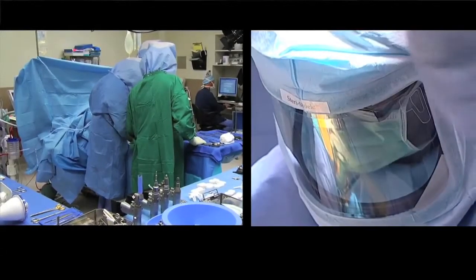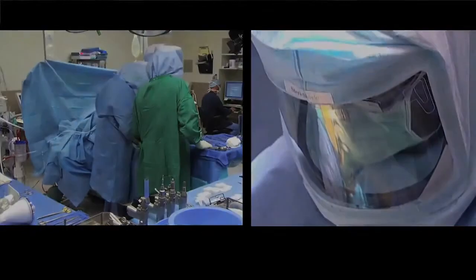So what it means for the surgeon is that in every single surgery he is confronted with having to find compromises, having to oversize one condyle, the inside of the knee, versus undersize the outside of the knee, or vice versa, having to make compromises on the shape of the device. And what this translates down to is issues with patient satisfaction. What are their complaints? They have pain after surgery, they have difficulty walking downstairs, they have limited range of motion, they can't get back to the same type of physical activity that they had before they had arthritis. So that's just a summary of some of the issues.